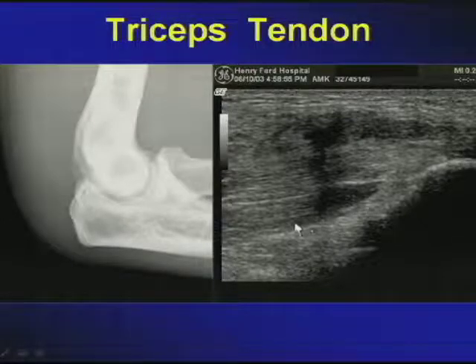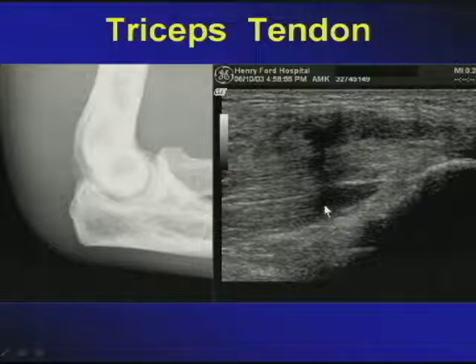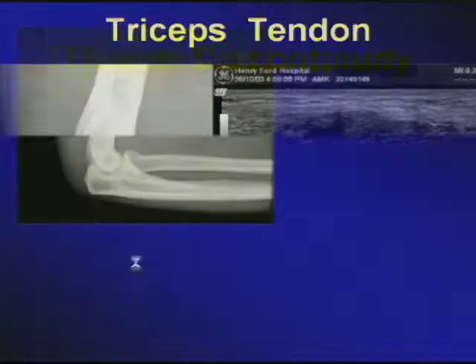Not only does it transect through the multipennate structures of the muscles surrounding the tendon, at the musculotendinous junction, but also you'll get to appreciate the fact that it transects the fibrillar pattern of the tendon proper and then spills over to the virtual space of the olecranon bursa. So now you've got a tear and a hemobursitis accompanying this patient's complaint, just like we said, as expected because of the soft tissue swelling.